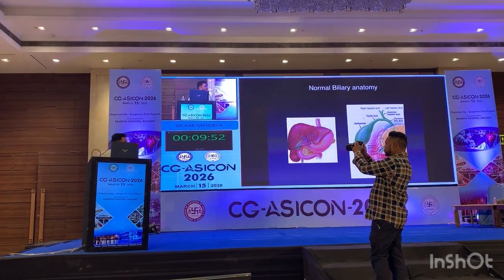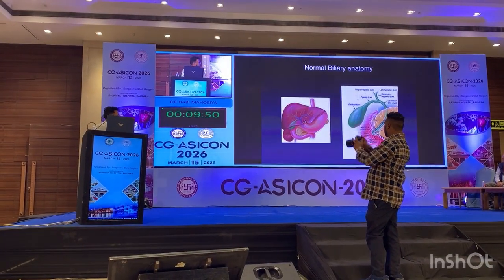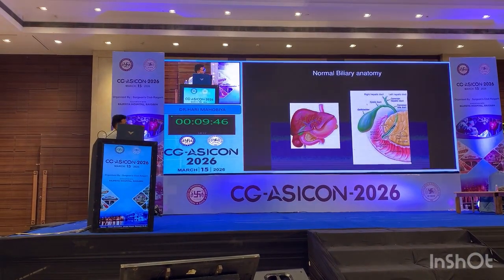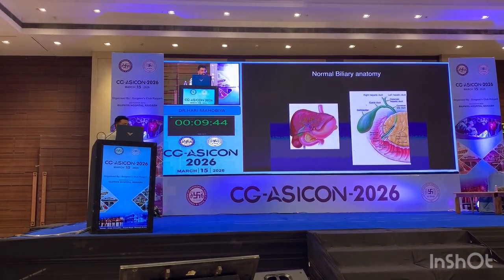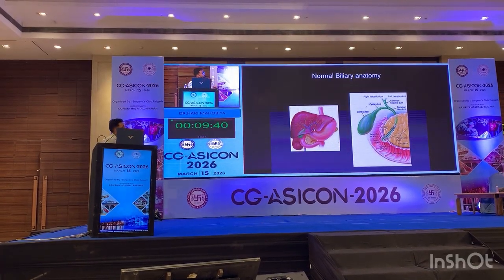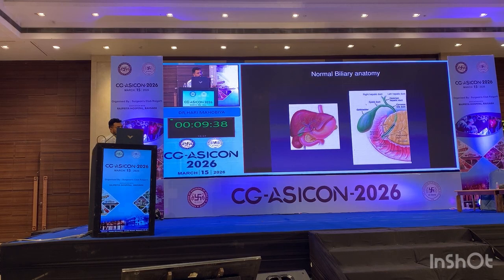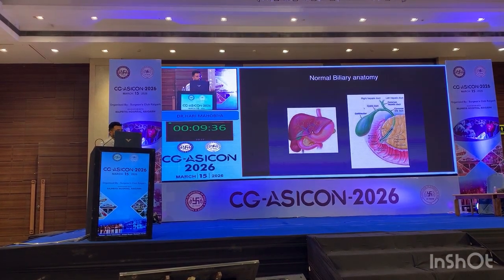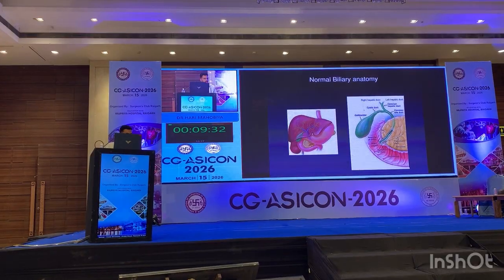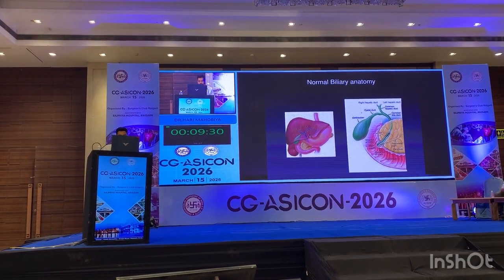So we are all aware of this anatomy, and we know the bile duct stone below the cystic duct we can deal with by ERCP, but a bile duct stone stuck in the right and left hepatic duct requires something else to be done. So what is cholangioscopy?